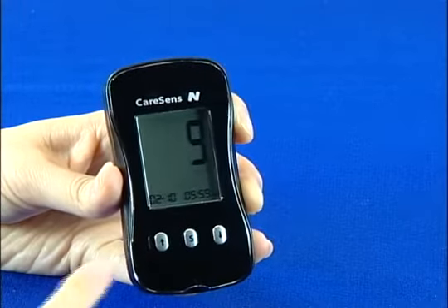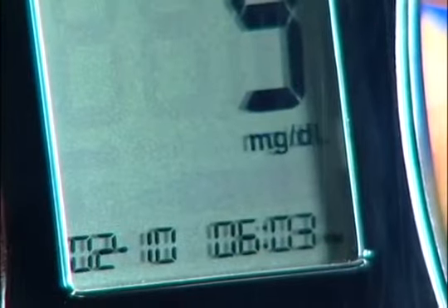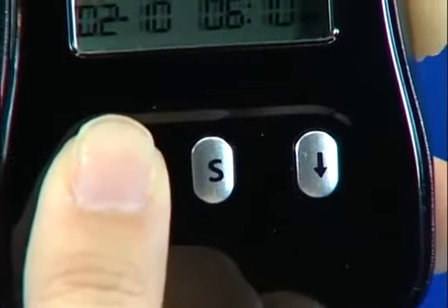You may be able to change the unit of measurement between milligrams per deciliter and millimoles per liter, but your meter may be permanently fixed to one of the units for safety reasons. If allowed, the unit can be changed using the left or right arrow buttons.